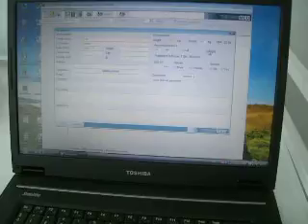Usually we prefer to measure on the dominant arm. So if she is a right-handed person, we will measure on the right upper arm. Now one of the most important things is the jugulum-symphysis distance measurement, and I will show you how to measure it.